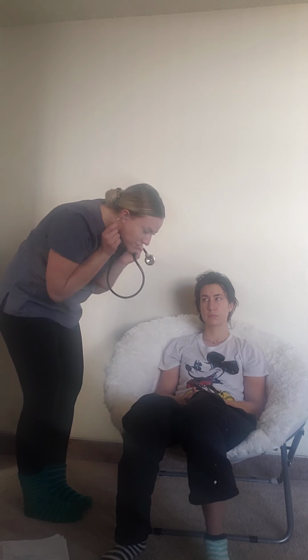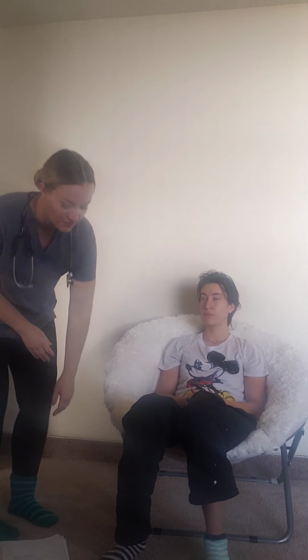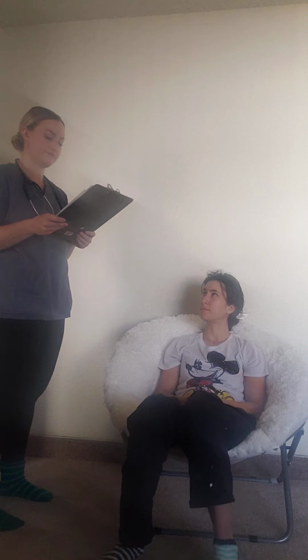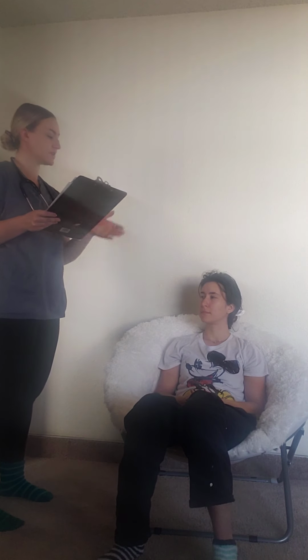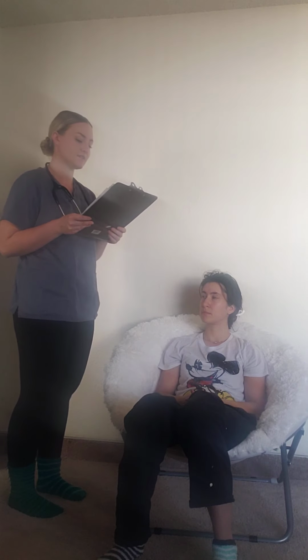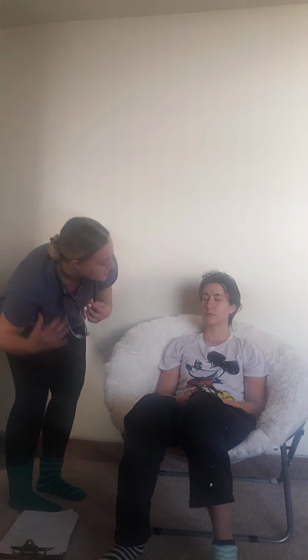It's been about 1 full minute. Regular heart sounds. It's 65, so it sounds good. Have you ever had any trouble with your heart? No. All right, so I'm gonna listen to all your heart sounds now. So that was the apical pulse. And next I'm gonna listen to your aortic heart valve, which is on your second right intercostal space.